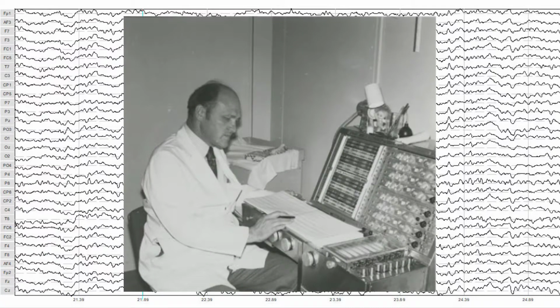In the past, EEG equipment had relatively low input impedance, i.e. 10 megohm was common, which necessitated aggressive preparation of the skin by abrasion and removal of dry skin layers to reduce the impedance of the signal path between the body and the electrode to 10 kiloohms or less.